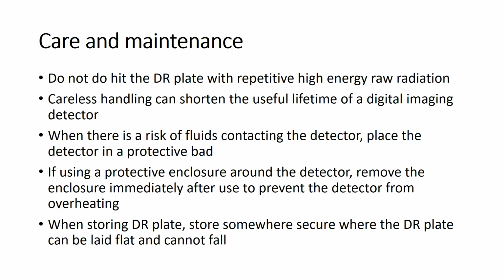Care and maintenance. For the DR system, do not hit the DR plate with repetitive high energy radiation. Careless handling can shorten the useful lifetime of the digital imaging detector.